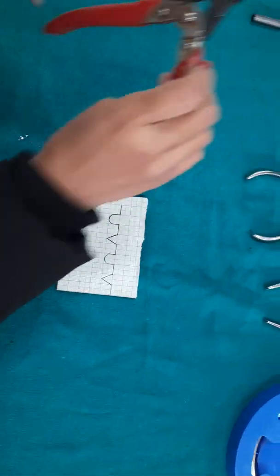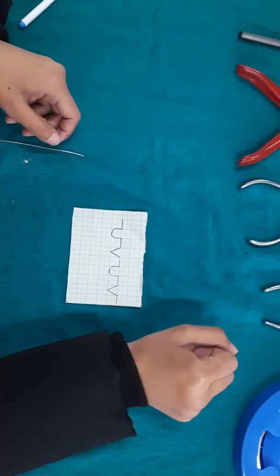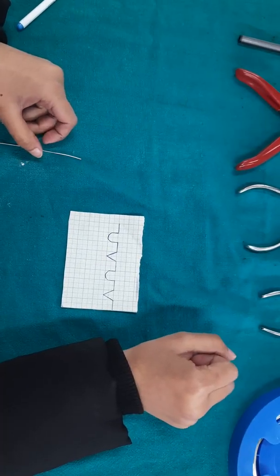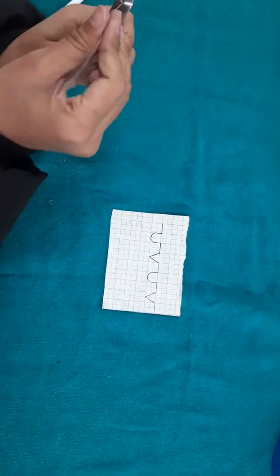Now we will cut an appropriate length wire using a wire cutter. Now the wire has to be straightened using the plier.